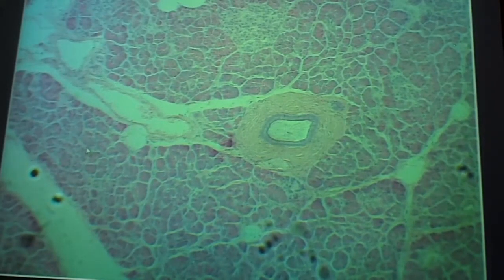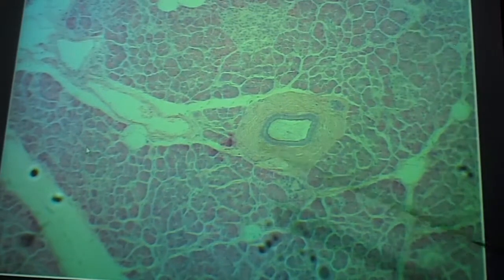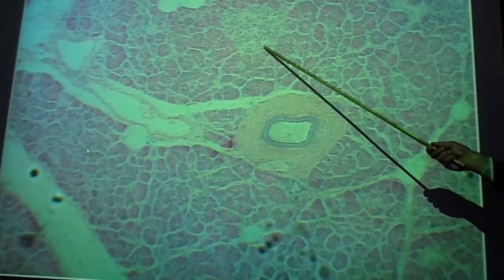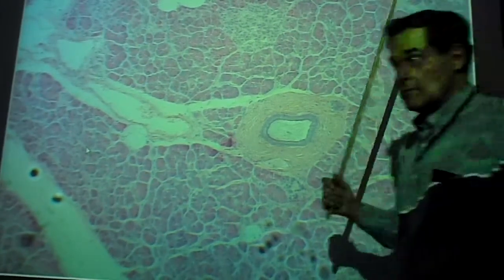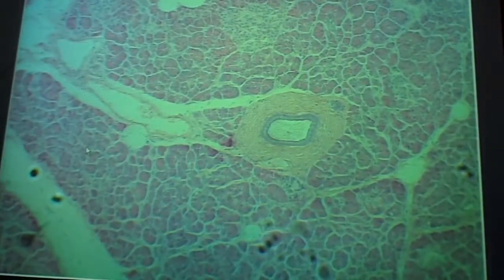But look at these slides. Don't just go to the slideshow. Right? I'll do another slideshow review on Monday. You said the islets of Langerhans were, right here. Lighter stain. Yes. Okay. They produce the hormones insulin and glucagon.